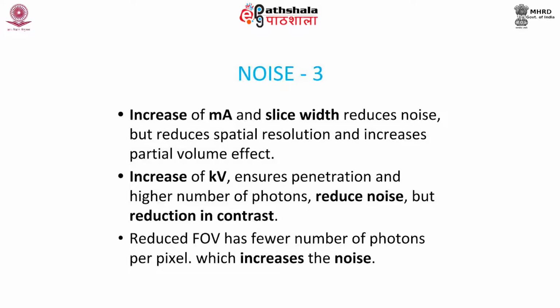Increase of mA and slice width reduces noise but also reduces spatial resolution and increases the partial volume effect. Increase of kVp ensures penetration and a higher number of photons reduces noise, but also reduces the contrast. Reduction of FOV has fewer photons per pixel, which increases the noise.